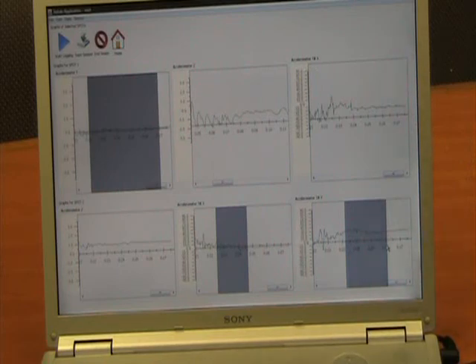Our next steps would be to be able to do some form of pattern matching to the data selected.